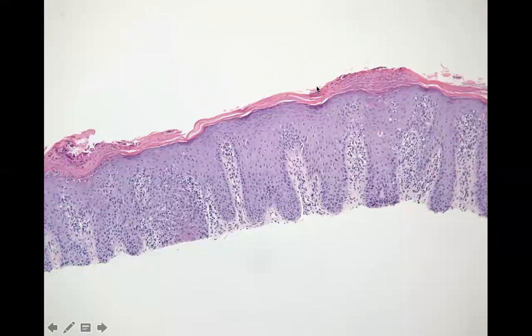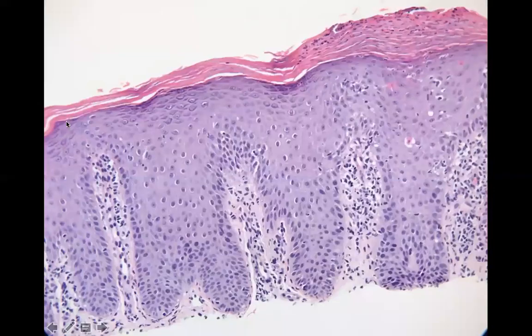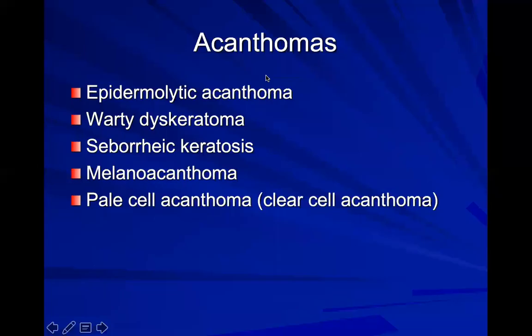Here's another example of ILVEN. You have this area that looks, for all intents and purposes, exactly like psoriasis, loss of granular layer, neutrophils in the dry cornified layer. And then you have this area where you have a granular layer, no neutrophils. And then you skip back to an inflammatory area where you have the neutrophils and the parakeratosis. Okay, those are your little cutoffs. Here's the up close, right? Where you cut off right here. And you've got the psoriasis and the not psoriasis look.